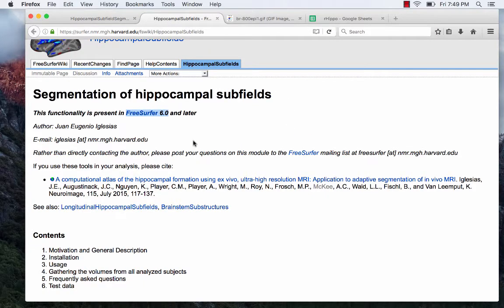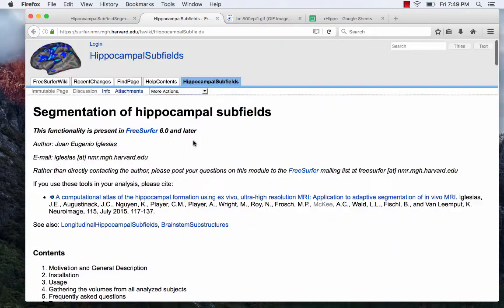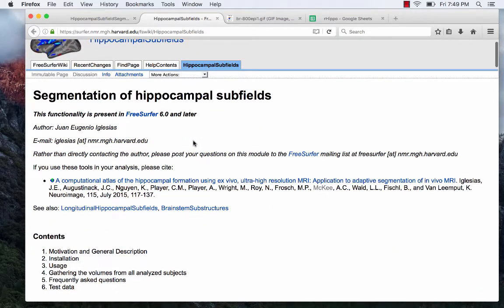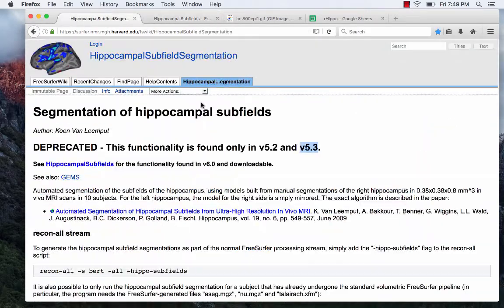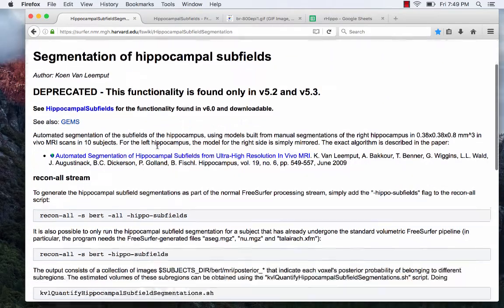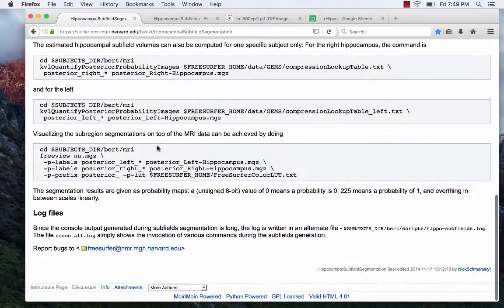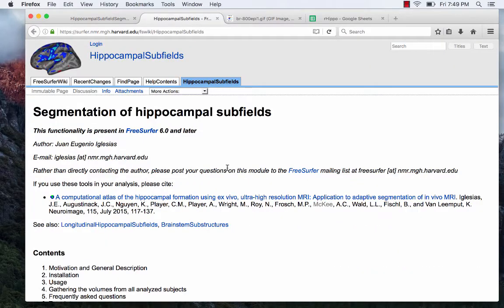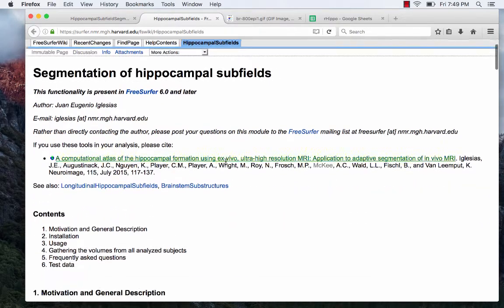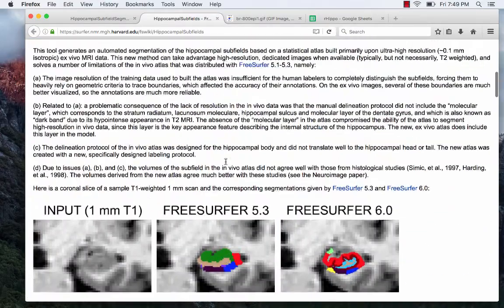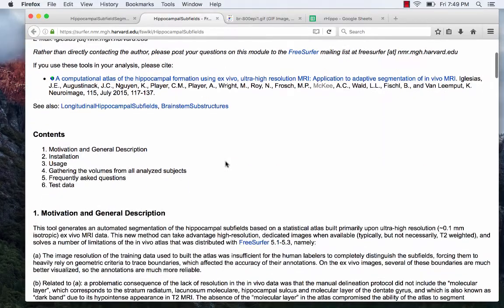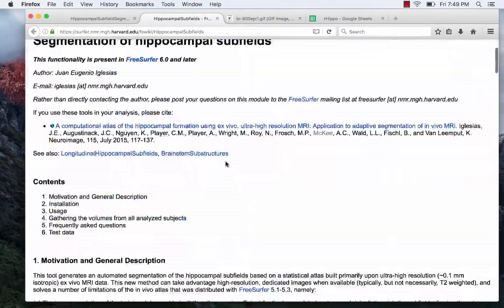I have no idea when they're going to release 6.0 — it could be tomorrow and this whole video could be out of date. I saw on the forums months ago people talking about 6.0 and it still hasn't been released. There is still a way to do hippocampal subfield segmentation using 5.3, and there's a page for that. The tags are different, so if you try to run the 6.0 tag using the 5.3 version you're going to get an error.